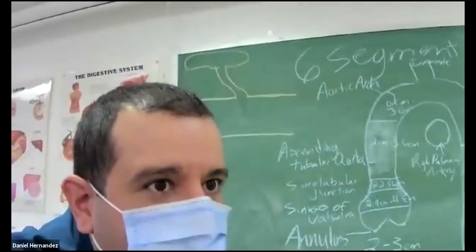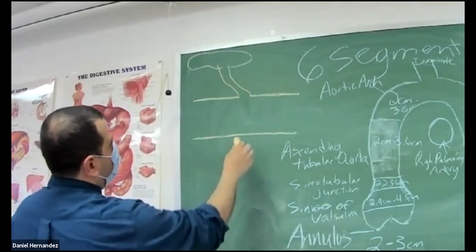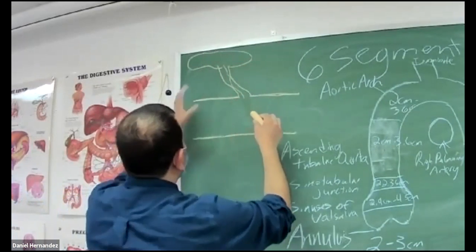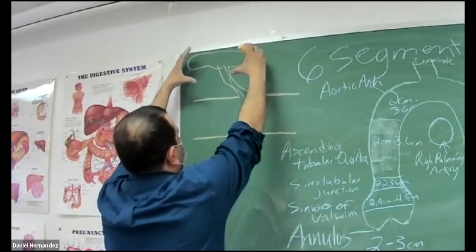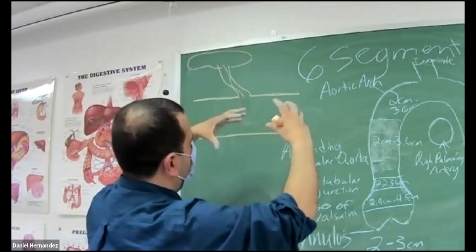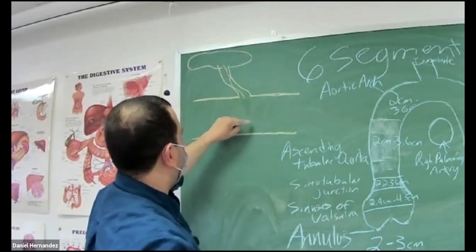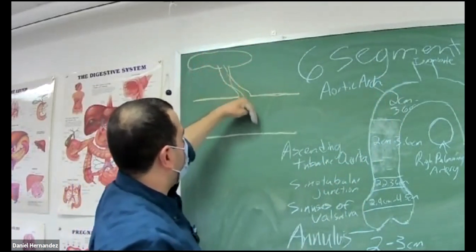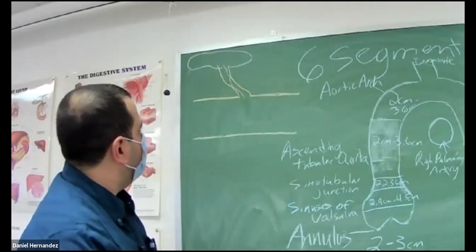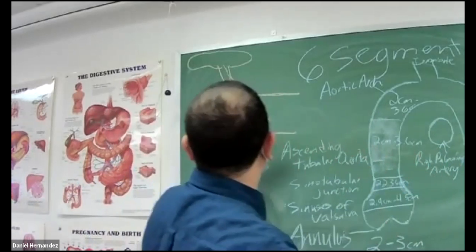So this is more of a pseudoaneurysm. You have rupture of all the layers of the vessel. Blood flow is leaking out, coming into the body or whatever space it is in, and collecting, and it forms a large hematoma or a collection of blood. And the body's encapsulating and keeping it there, trying not to let it spread everywhere. So blood flow is coming up the neck, going in there, swirling around, coming back out the neck. So that's why when you Doppler this neck, you get that bidirectional flow. So a pseudoaneurysm is different from an actual dissection.